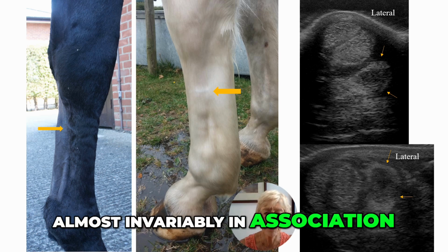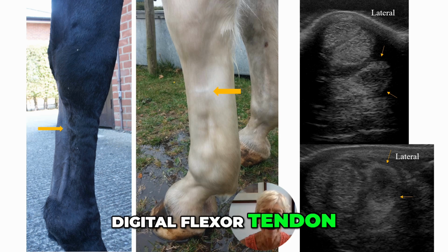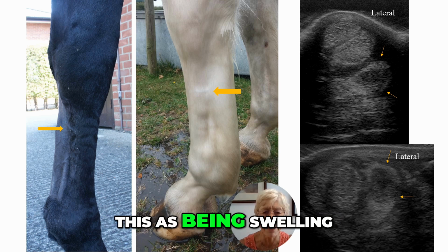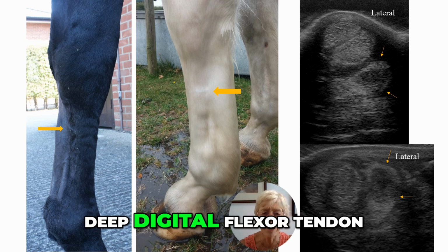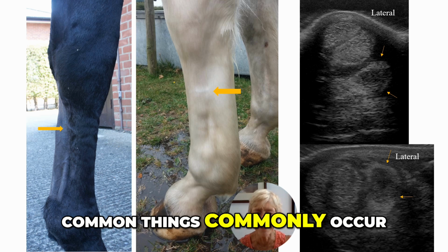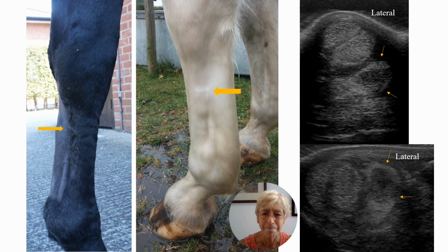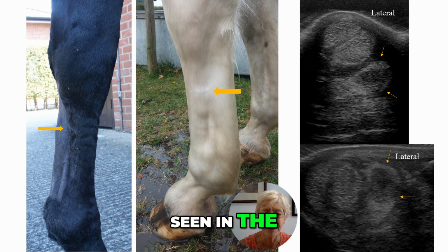Almost invariably in association with the majority of injuries of the accessory ligament of the deep digital flexor tendon, there is palpable swelling. If you're new to the game, you may misinterpret this as being swelling involving the deep digital flexor tendon. But injuries to the deep digital flexor tendon are very rare in this location. Common things commonly occur, and it is highly likely to reflect enlargement of the accessory ligament of the deep digital flexor tendon. Typical ultrasonographic images are seen to the right.